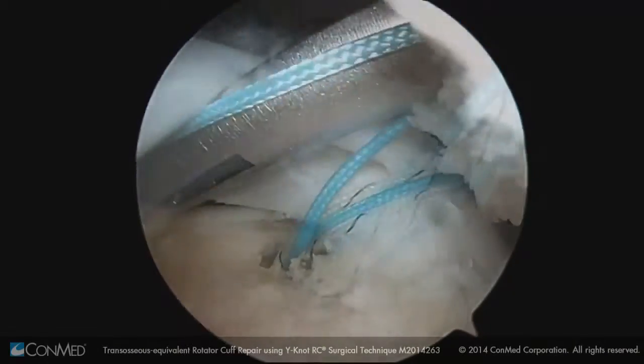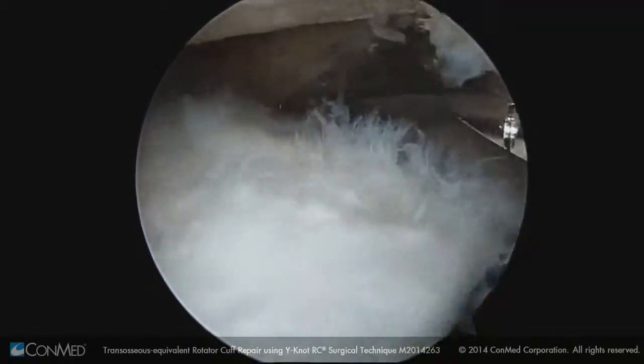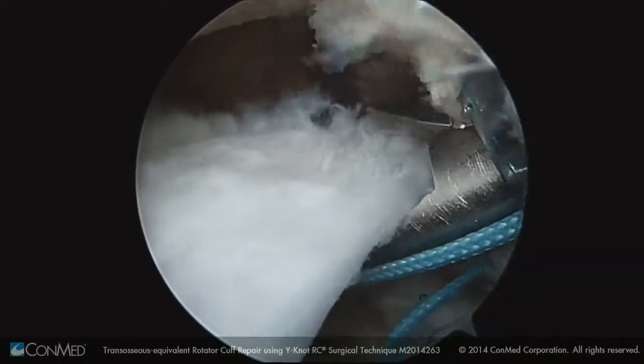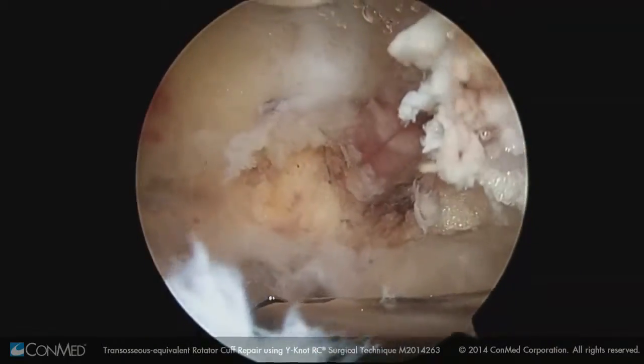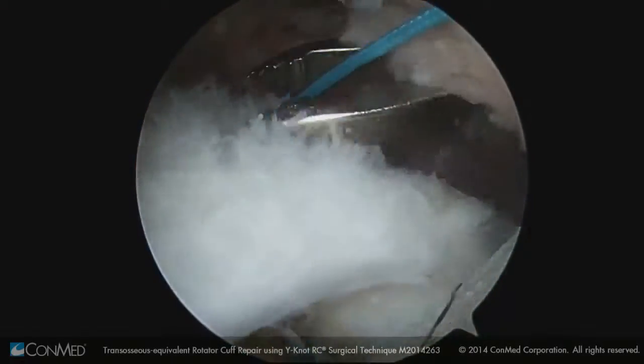One thing you may notice was the efflux of marrow elements that came out when we set the anchor, and I've noticed that there anecdotally is a significantly greater amount of marrow efflux with this type of anchor than a typical screw-in anchor that gives you aperture fixation.